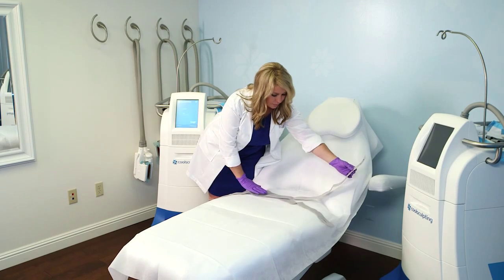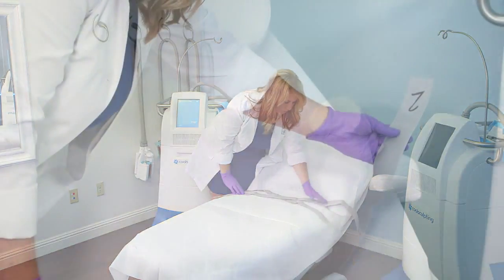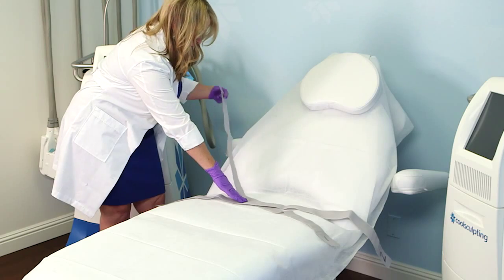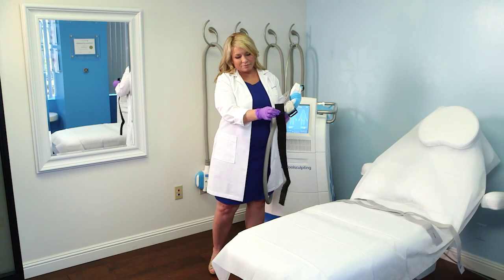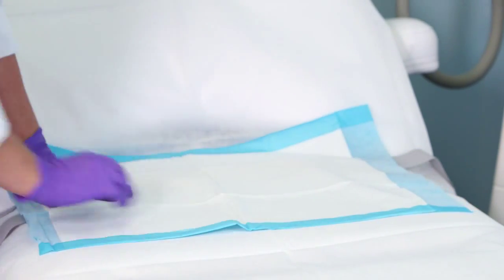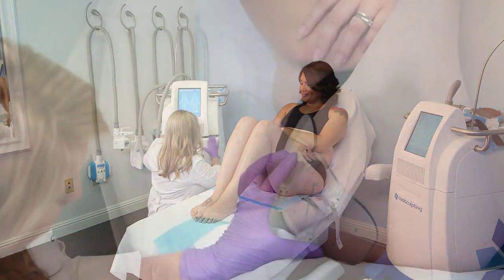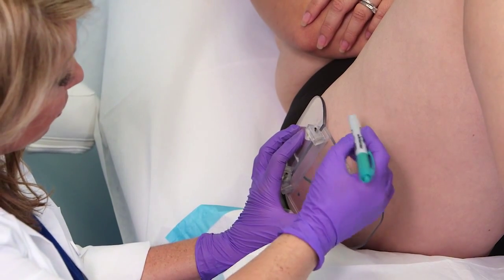Using a permanent marker, number the disposable gray straps: number the first gray strap with one on each side and the second gray strap with two on each side. Position the gray straps felt side down on the bed — they should be slightly crossed and positioned with enough slack on top to wrap around the body. Attach the black strap to the securement anchor closest to the applicator umbilical. Place an absorbent pad or towel over the gray straps for patient comfort. Position the patient seated upright on the treatment table with knees bent and feet flat on the bed. Center the CoolSmooth applicator planning template over the peak of the bulge and confirm that all three panels are in direct contact with the skin.